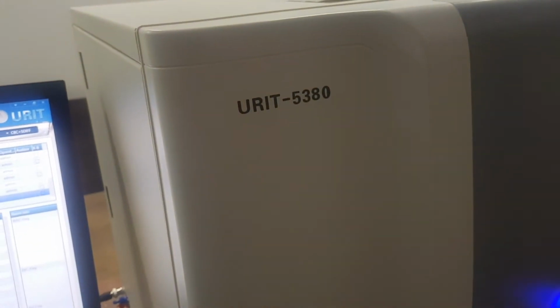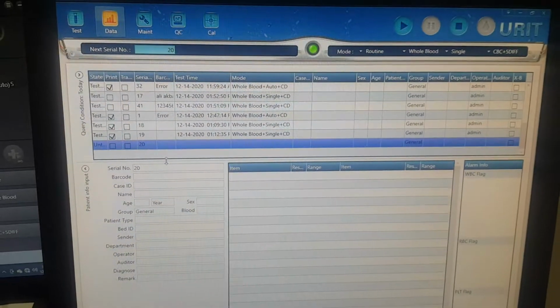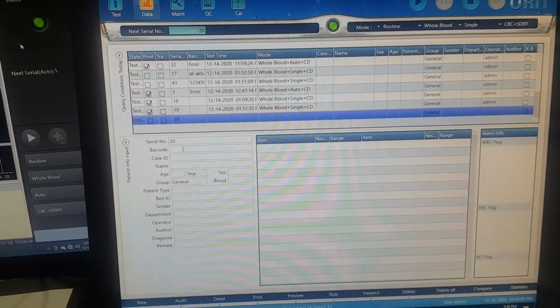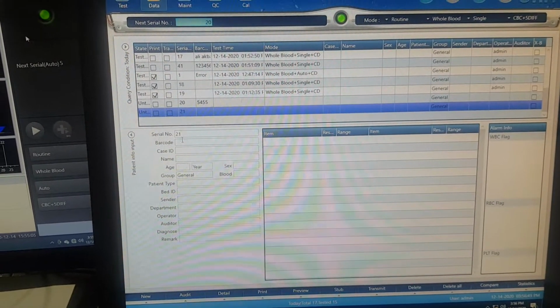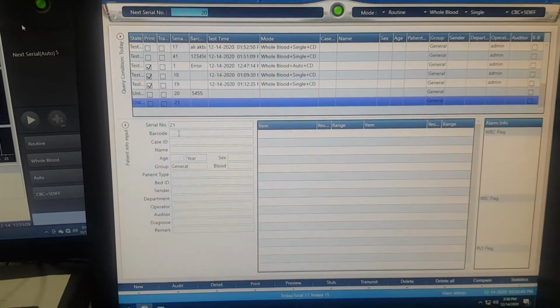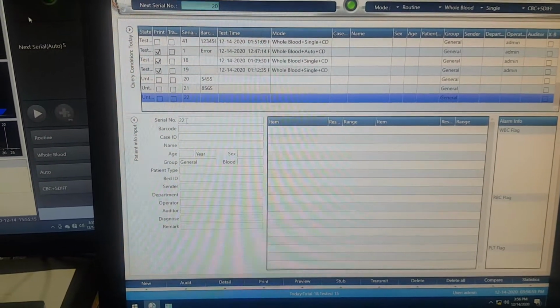Okay, this is 5380, and now we are working with 5380 software. This is the new work list. When we press new and we press a barcode, and again when we press new, the serial number comes automatically, and again we put the sample ID or barcode, and when we press new, the serial number comes automatically.